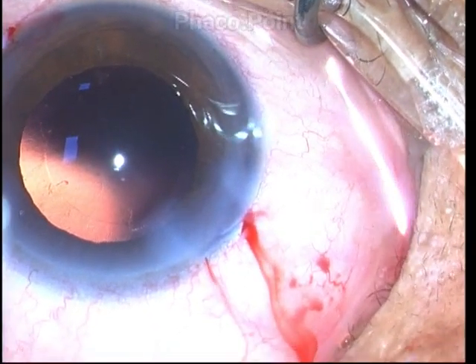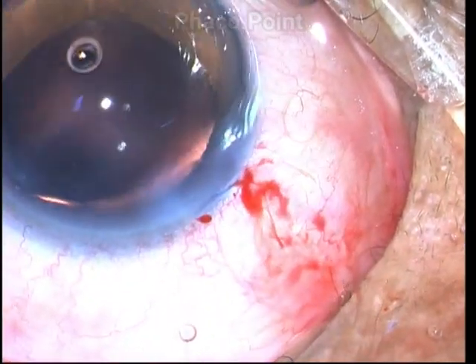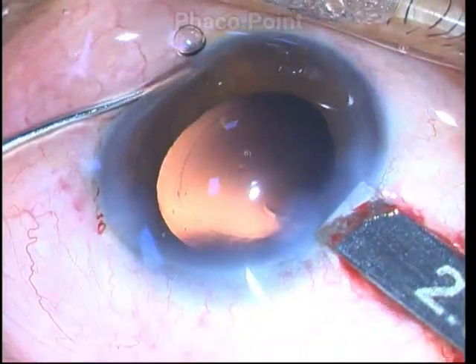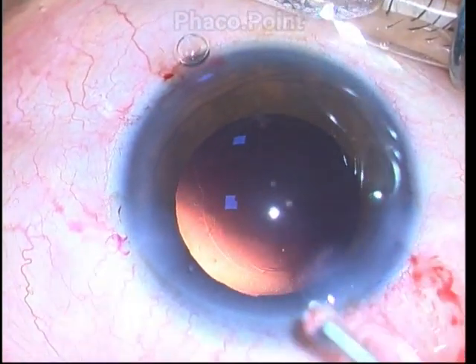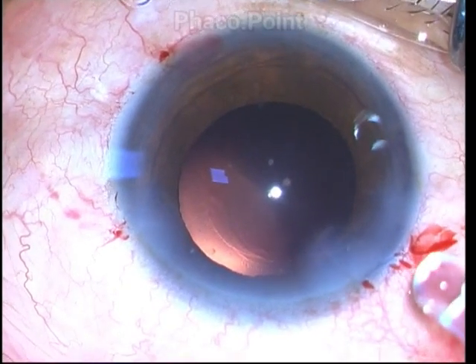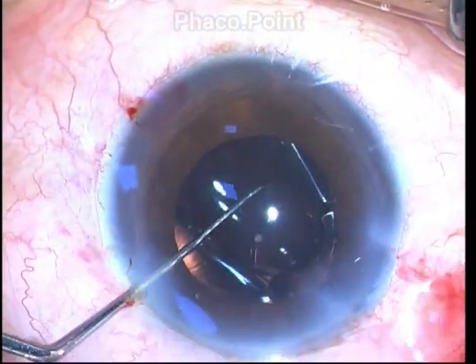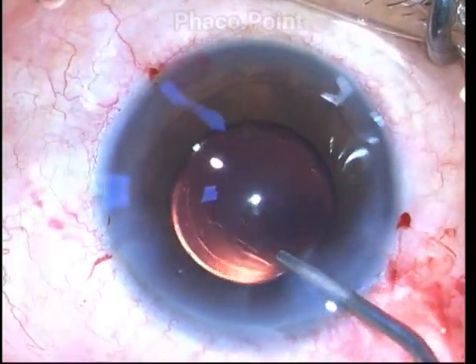In case example number two, we go directly to the point where phacoemulsification and irrigation-aspiration have been completed. The size of the incision is checked before implantation and is just about 2.8 mm; the 2.9 mm caliper is not able to enter. In this case, I use an IOL with a Monarch cartridge — meant for a 2 mm incision — which has a 4.5 mm cylindrical segment on the nozzle. I inject the IOL, carefully placing it within the capsular bag. After implantation, there is absolutely no extension or enlargement of the clear corneal incision.